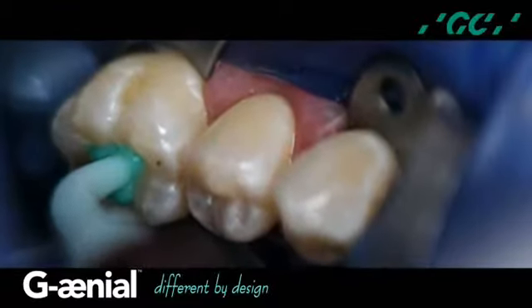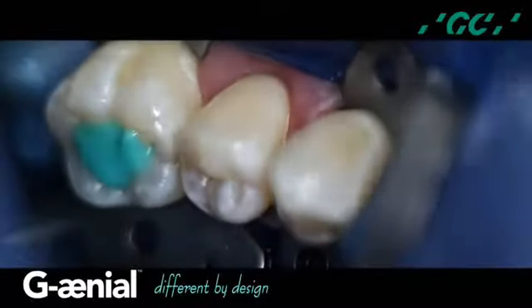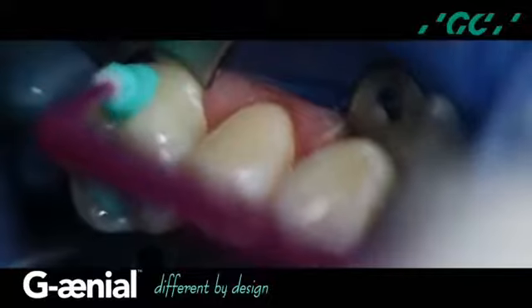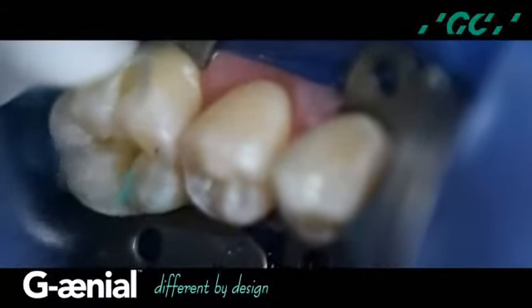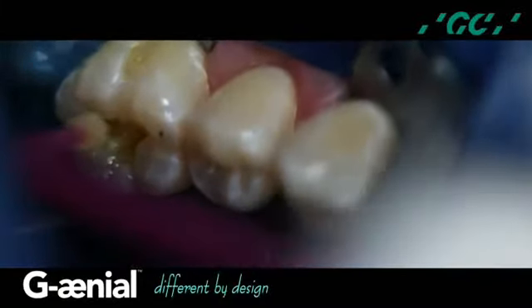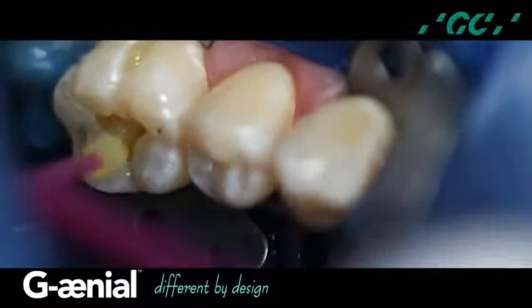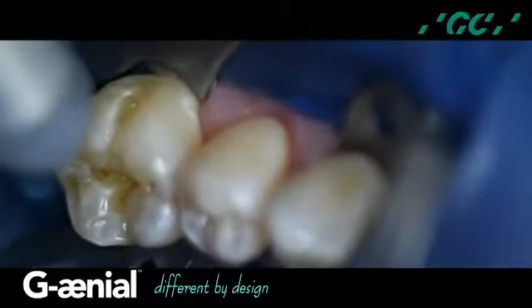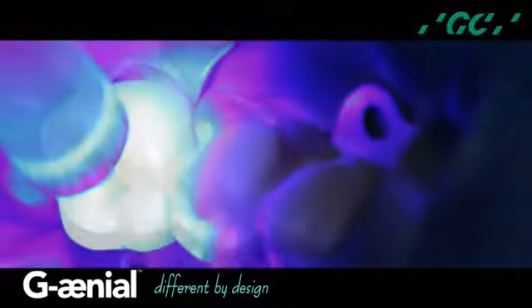The preparations are disinfected using a 2% chlorhexidine solution, Concepsis by Ultradent. Agitated with an applicator tip, rinsed for 5 seconds, and the excess water is vacuumed. A self-etch adhesive, G-aenial bond, is placed on the prepared enamel and dentin surfaces with an applicator tip. Allowed to dwell 10 seconds, dried for 5 seconds using an ADECT warm air tooth dryer, and light cured for 10 seconds.